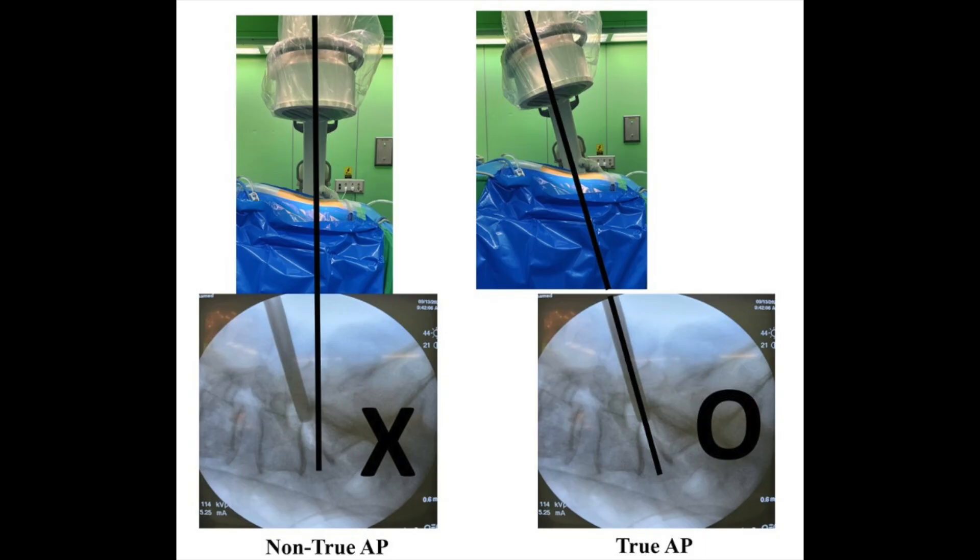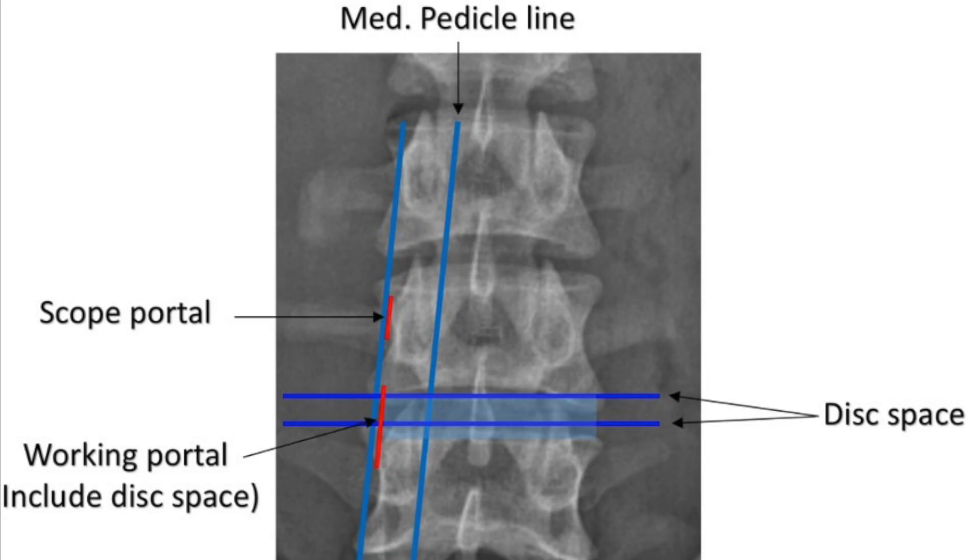The surgery is performed under general anesthesia with the patient in the prone position. When using the C-arm fluoroscope for positioning, it is crucial to achieve a true AP view. This ensures that the incision and the intervertebral endplate are aligned, facilitating smoother cage insertion. The incision is aligned for percutaneous transpedicular screw insertion with a vertical approach. For this patient, the approach is from the left side.